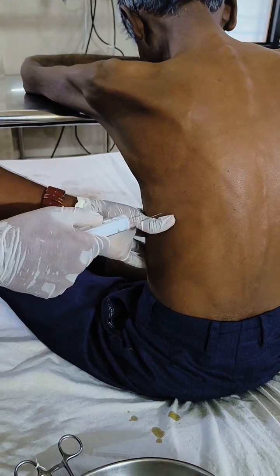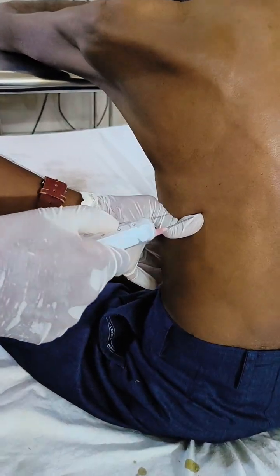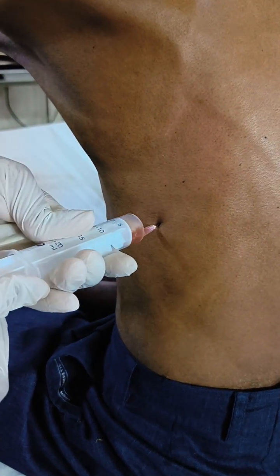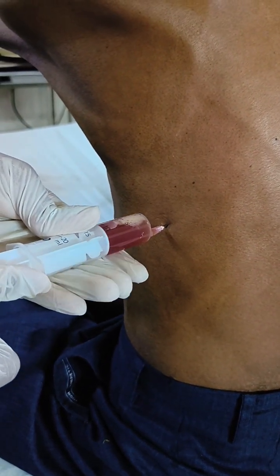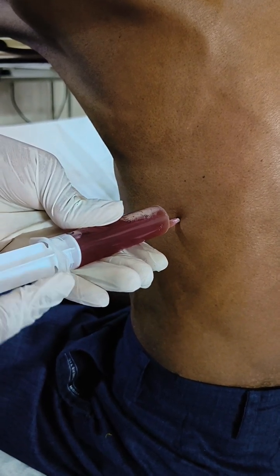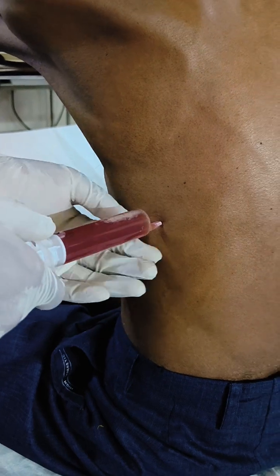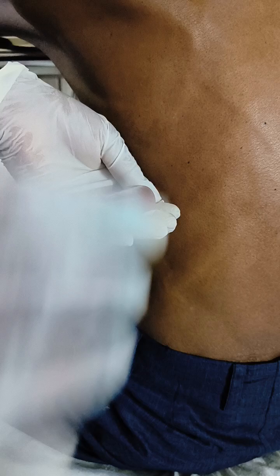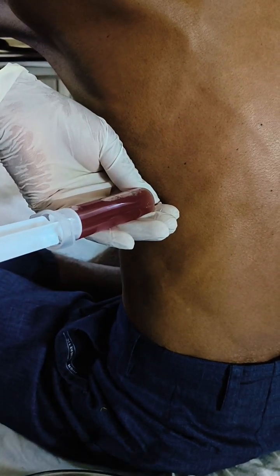See very carefully. See this fluid. Now it is coming. You can observe the fluid color. It may be red color, dark color, not totally red, like chocolate color. So we took 20 ml fluid now.